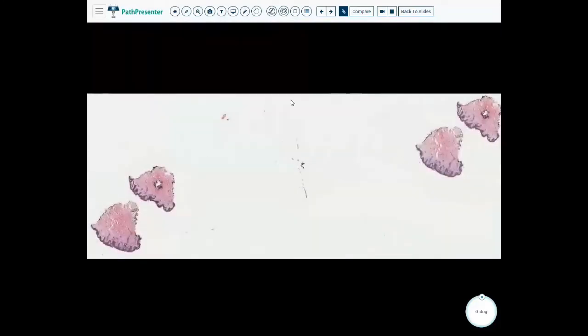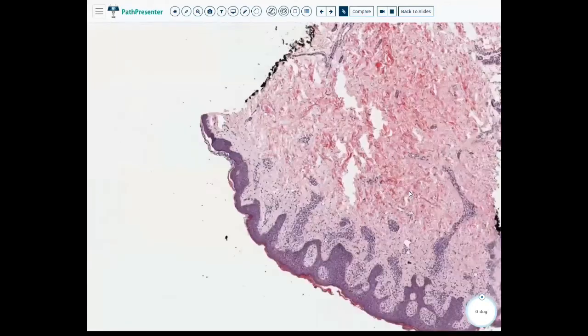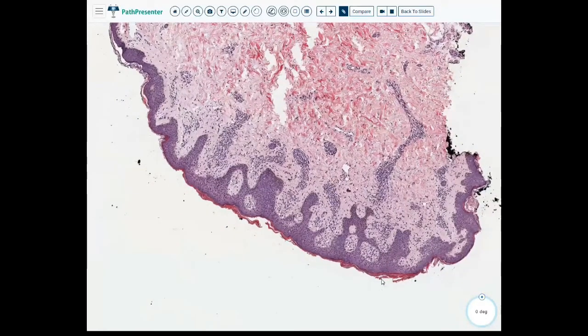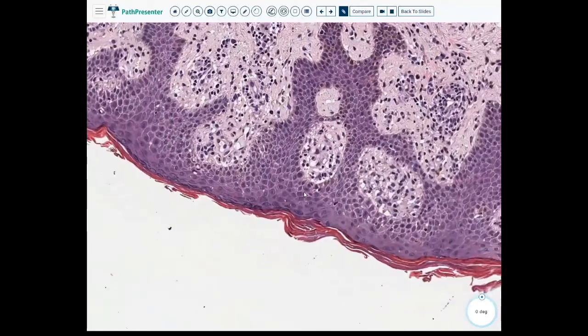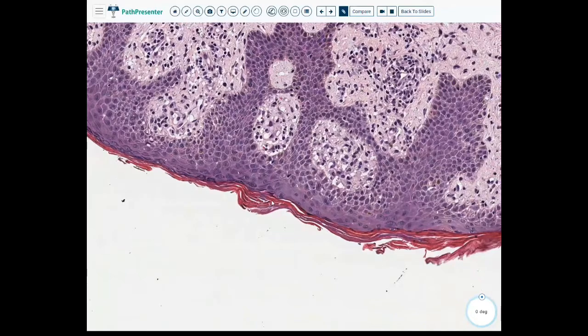And just to give you another look. These are the same cut, so you can envision that this is kind of the line between them. So I guess we'll look at these two over here. And what we notice is that there isn't any hyperkeratosis. There maybe is a little irregularity in the epidermal layer, especially here. Even with this being tangential, if we imagine that it's cut at an angle, this still seems to be too much. Let's take a look closer. What we see right away is that there is parakeratosis.